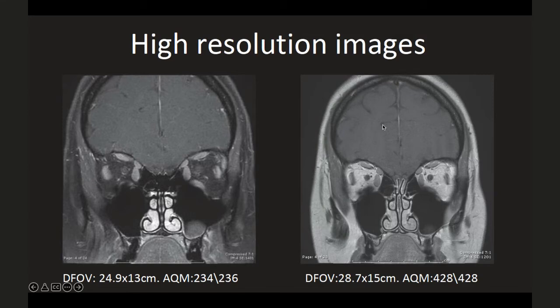So when you say I'm going to get an MR brain and you're expecting me to talk about the orbits, then I would say, why didn't I get a good history? Because I would have gotten you a dedicated orbital protocol, because these are high resolution images specifically dedicated. In that small space, I'm focusing only on the orbital structures, ocular structures, and going back to the brain, I'm ignoring the rest of the brain. So the field of view is very small, so the resolution is really good. Hence, it's important for me to know exactly what you're looking for.